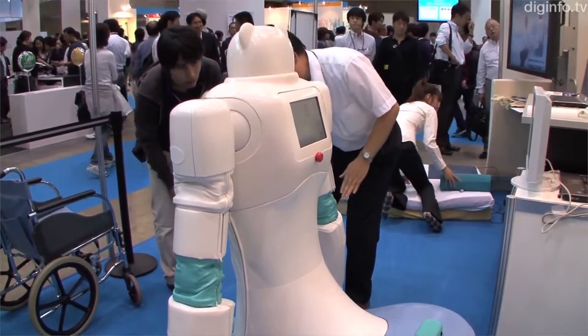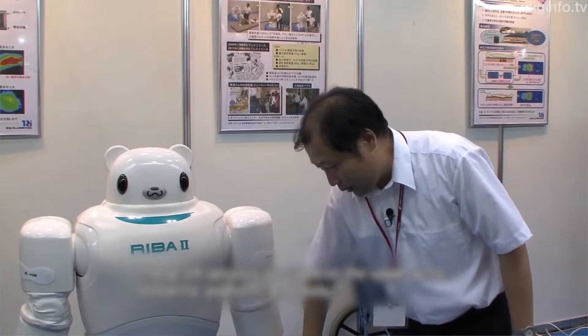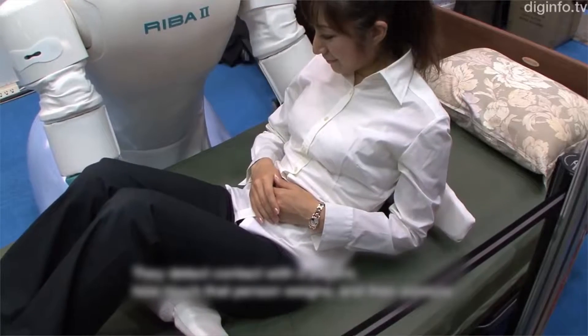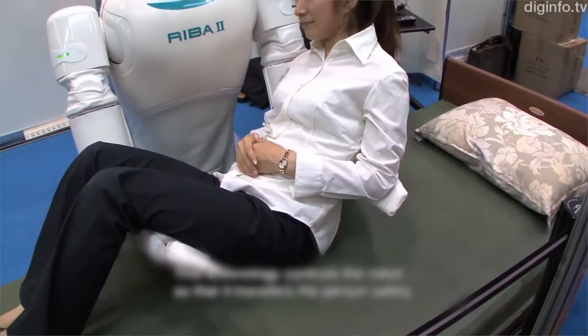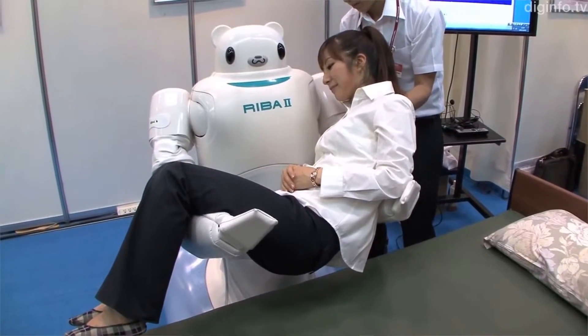RIBA II accomplishes this task using the newly developed Smart Rubber Sensors, the first capacitance-type tactile sensors made entirely of rubber. Printed in sheets and fitted onto the robot's arms and chest, the sensors enable highly precise tactile guidance and allow RIBA II to quickly detect a person's weight from touch alone, guaranteeing patient safety.